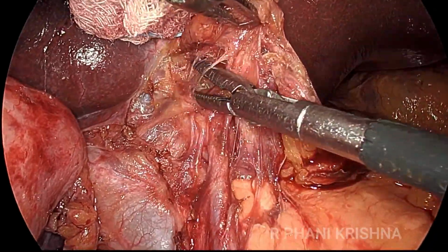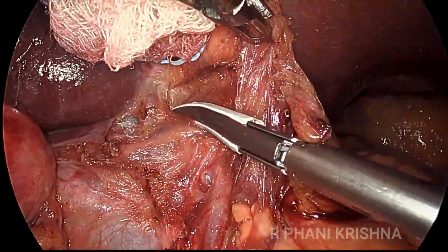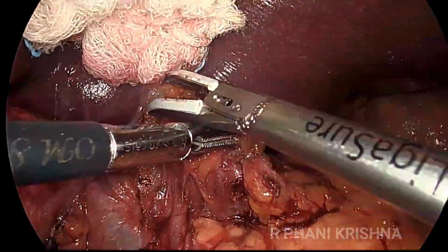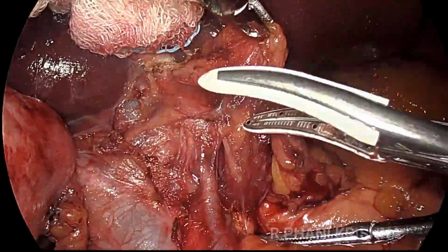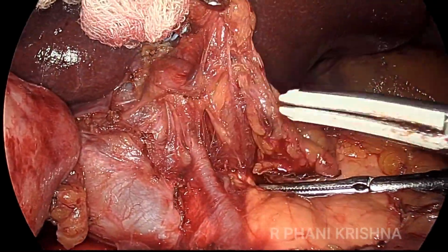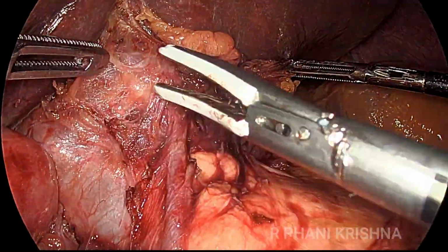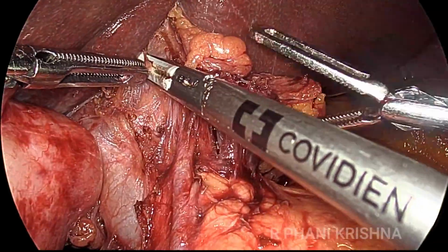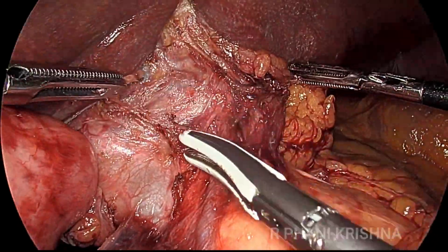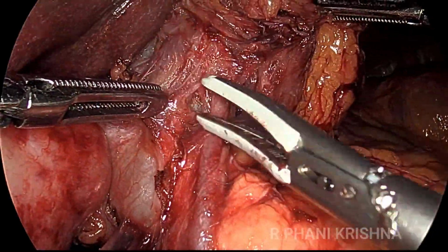You can see the proper hepatic artery there dividing into the left and giving off the right hepatic artery, and it's being detached off the left lobe hilum also. So here now we are dissecting in the groove between the hepatic artery and the bile ducts, separating them progressively. Then we can identify the right hepatic artery there.